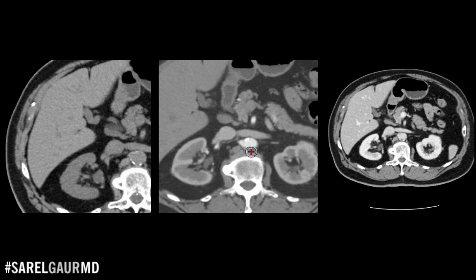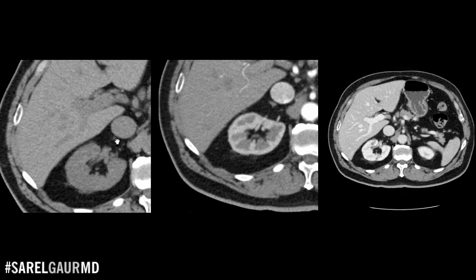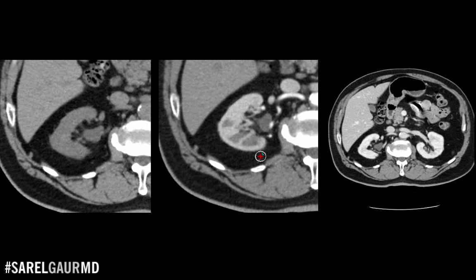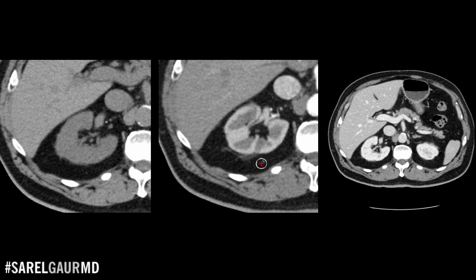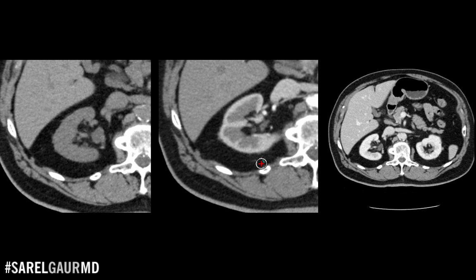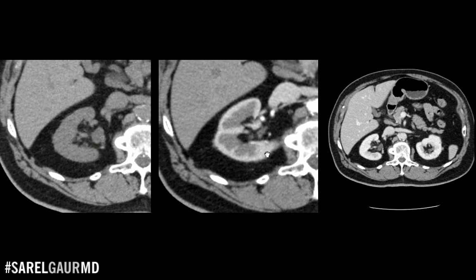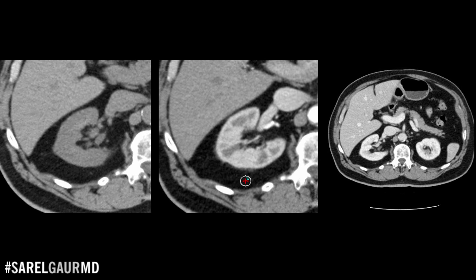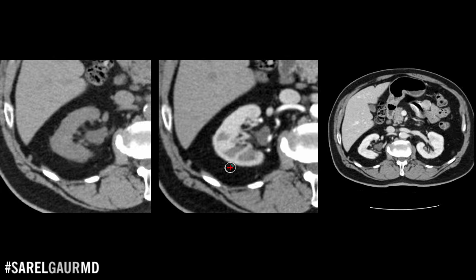Coming down to the kidneys, there is a characteristic enhancement pattern: differentiation of the cortex and medulla, which was not present on the non-contrast study. This gives both physiologic and anatomic information about the kidney. The kidney cortex contains the highly vascular glomeruli, and the medulla contains the tubules where the content of the urine is adjusted. So I'm seeing visual information about the internal structure of the kidney — information that was not present on the non-contrast study. I'm adding information to the system.